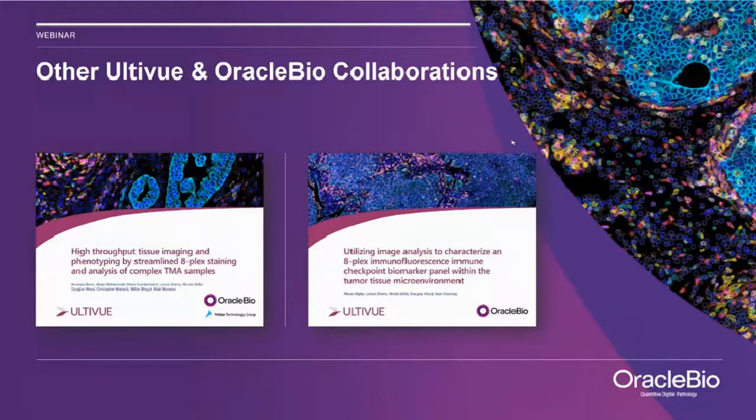Okay, thank you. And do you validate algorithms? And if so, what do you do? Yeah, I think this is a question I just addressed as part of one of the previous ones, with respect to the precision and robustness approaches, and the interaction of the pathologist to QC, based on the ground truth generated from the pathologist and the analysis data generated from the algorithms.